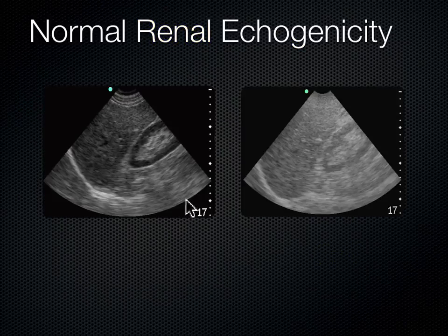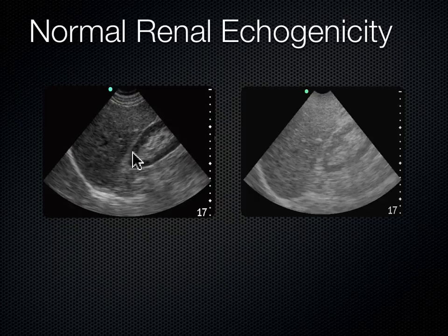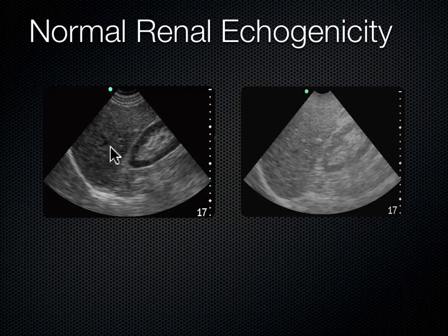Looking at these two images: they have the same depth, both ranging down to 17 centimeters, but the difference is the gain. The right image is over-gained — pretty washed out. The left image is properly gained. You can see the cortex of the kidney is slightly darker, less echogenic, than the liver. If you can make out those subtleties, you've got your gain adjusted just right. That's the art of gain.